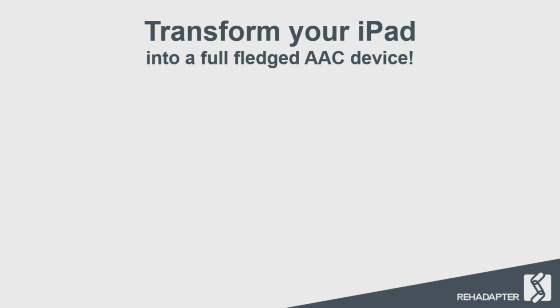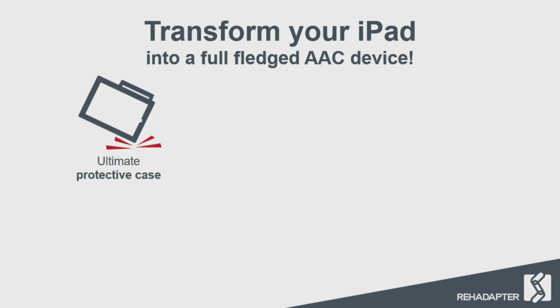It needs to have an integrated speaker, all different kinds of access methods to be used by various kinds of clients. It needs to have versatile positioning options and a weight that allows you to easily transport the solution, and so to have the maximum portability.